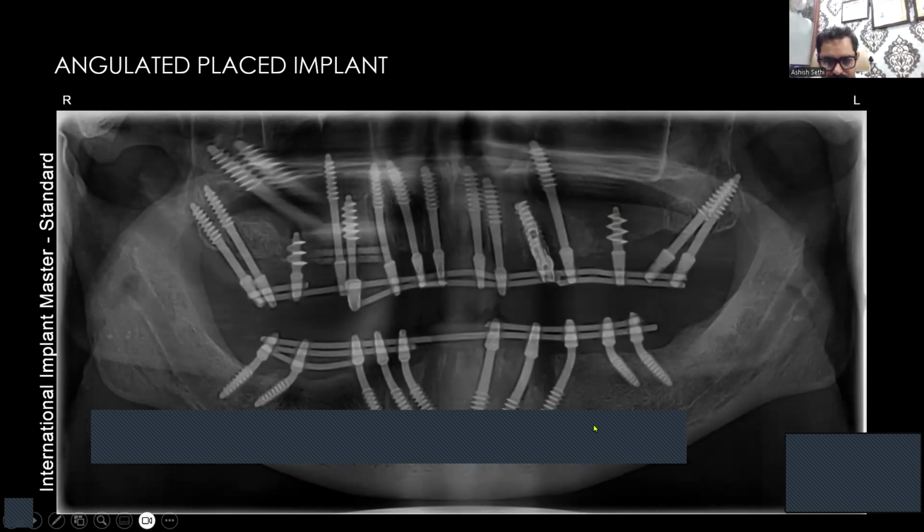और this is I told you कि फोरामेन के आगे में आप या तो 2 इम्प्लांट डालोगे या 3 डालोगे. तो we prefer to choose 3 over here and 2 इम्प्लांट पोस्टीरियर रीजन में. तो ये दोनों लिंगुअल कॉर्टिकल में एंगेज्ड है. ये आगे इंटरफोरामिनल रीजन में एंगेज्ड है. This is posteriorly टेरिगोइड में एंगेज्ड है. And this is anteriorly नेजल फ्लोर में एंगेज्ड है. This is how the locations work.